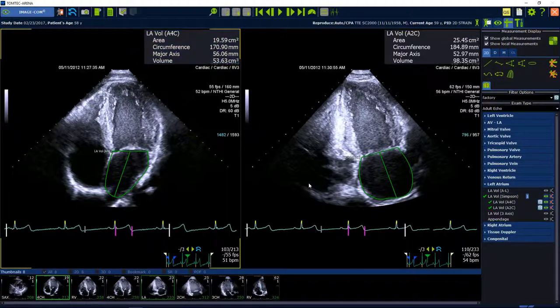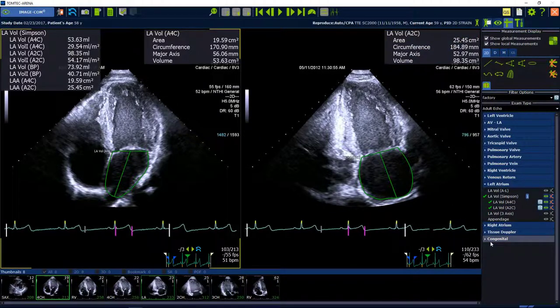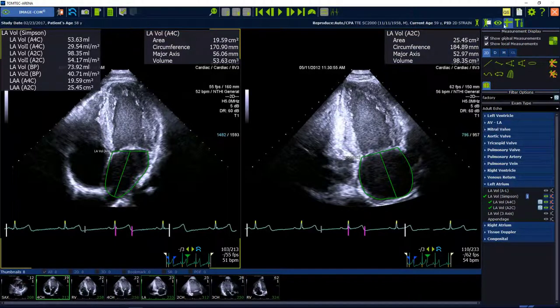If you move the mouse after the analysis out of the workspace, you will see all results in the left corner. Results can also be visualized in the worksheet.